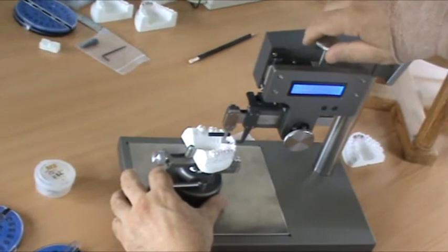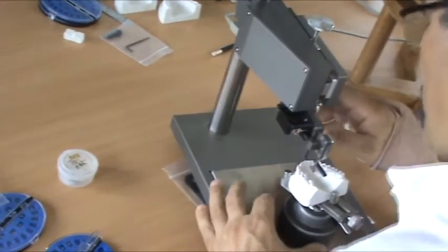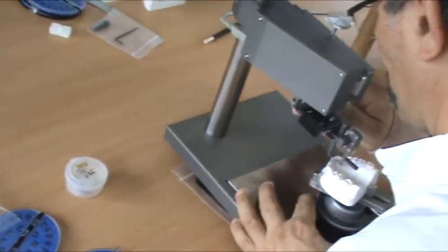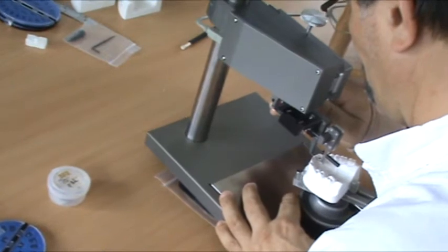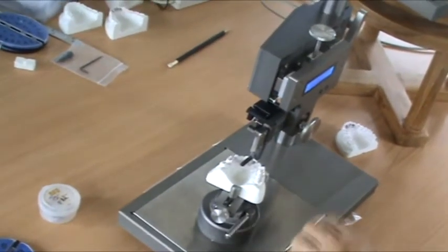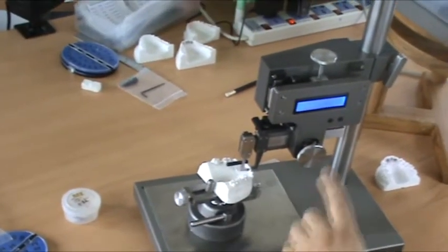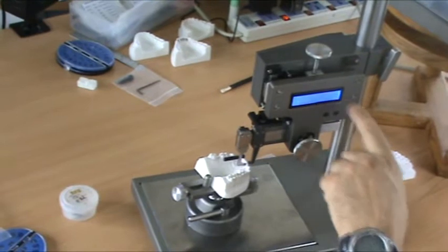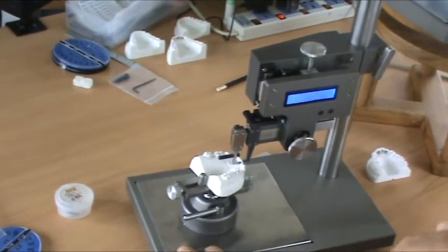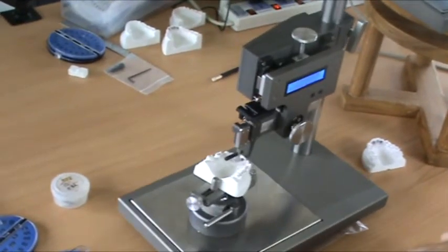Choose a measurement. Say 2.5. I want to test 2.5. And at that height, we can see where it fits onto the tooth, the relationship of the base, and what the thickness is from the slot to the vestibular base. That will just make our wires afterwards without too many bends.